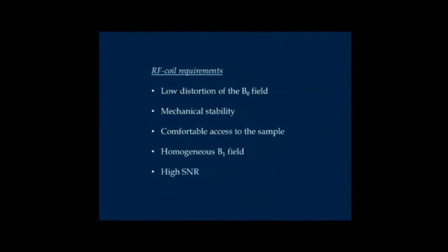You need, and this is not to be underestimated, a comfortable access to the sample. This is not that important in NMR spectrometers, where you just want to do a spectrum and it stays in a long time anyway, and you don't need to monitor any life signs such as breathing, and you don't need any access for anesthesia or some other things. Different in human applications and in biomedical applications, where you need to put the mice or the patients in and out, and you need to monitor their life, their breathing and their heart rate, for example.